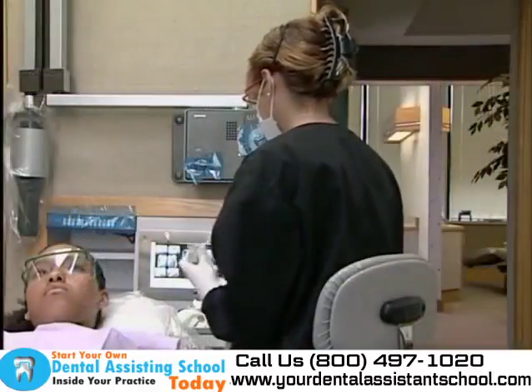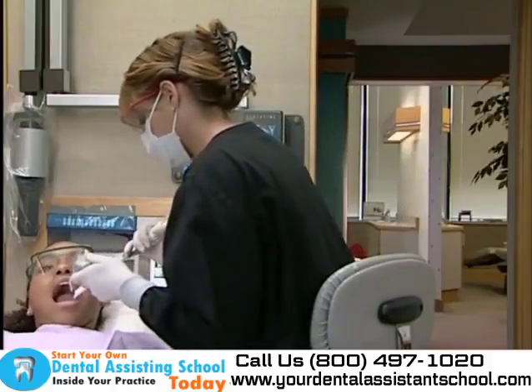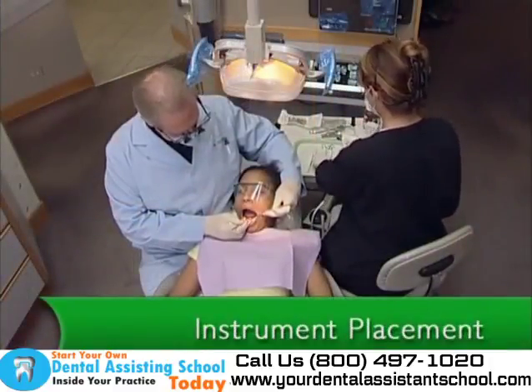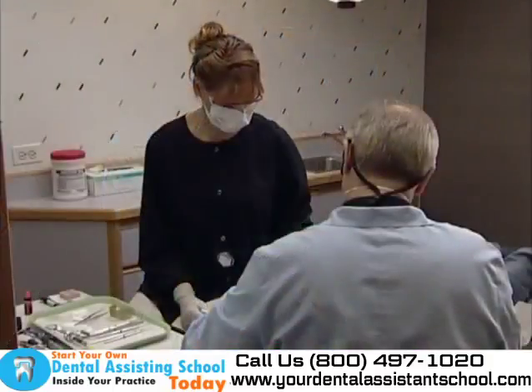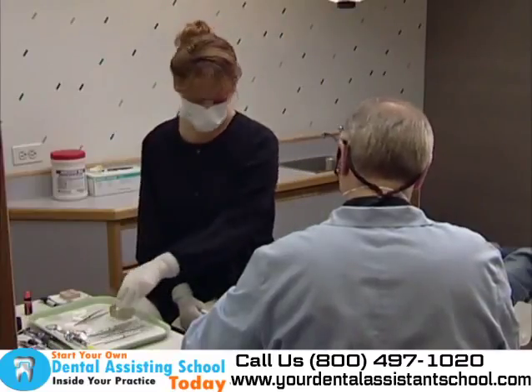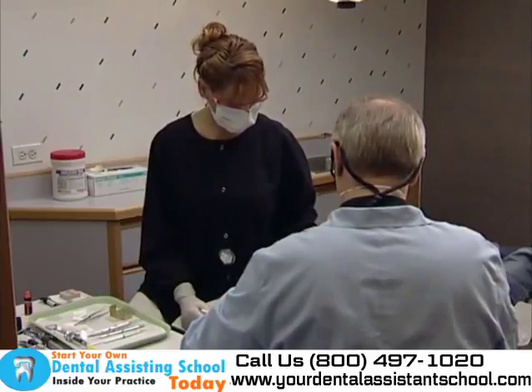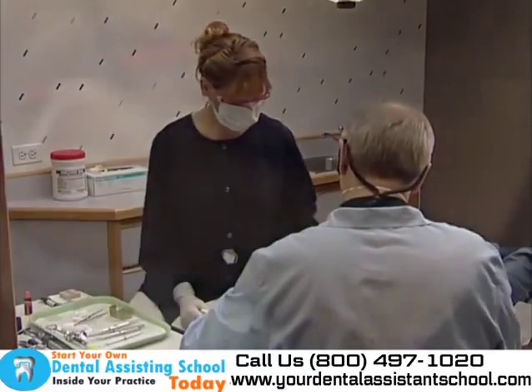The stool is placed as close as possible to the patient's chair, and the front edge is to be parallel to the patient's mouth. Most importantly, there needs to be easy access to all necessary equipment and to the patient's mouth. When passing instruments, a limited amount of movement is best. Movement of the shoulders or torso should be avoided if possible. This will help save time and energy, as well as reduce fatigue and stress of the body.